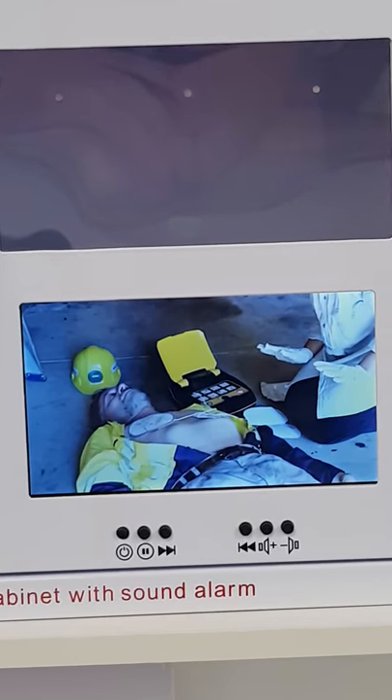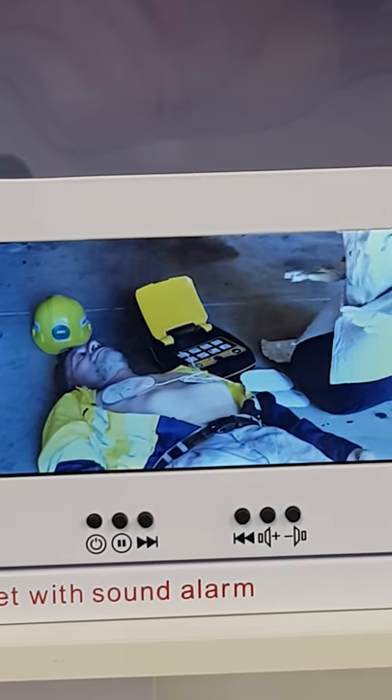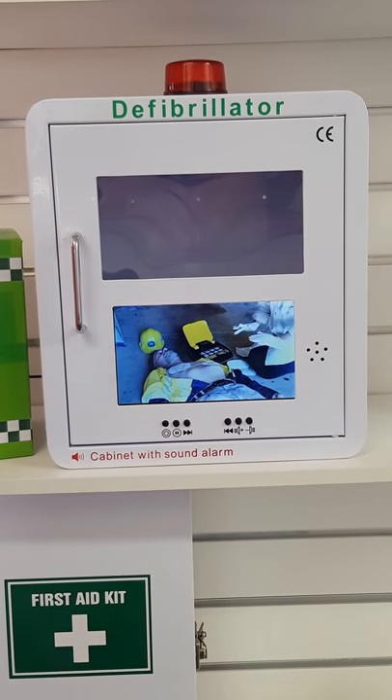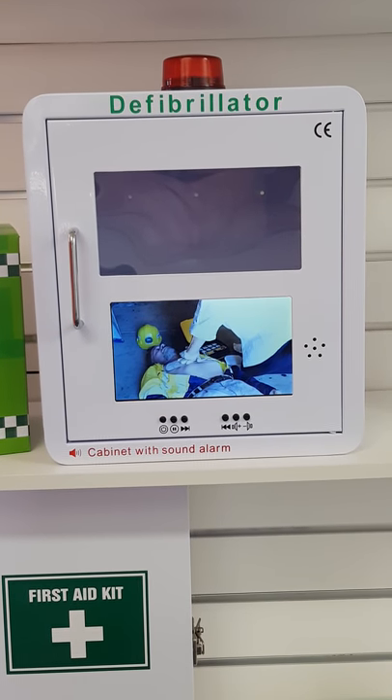Press the red flashing button. Shock delivered. It is safe to touch the patient. If no response, begin CPR. Let's go.